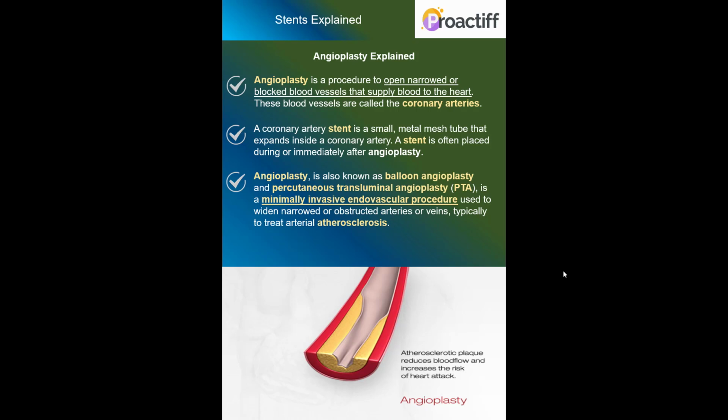A stent is often placed during or immediately after the angioplasty, wherein, as we'll see shortly, a balloon angioplasty, or percutaneous transluminal angioplasty, PTA in short, is a minimally invasive endovascular procedure used to widen narrowed or obstructed arteries or veins, typically to treat arterial atherosclerosis.